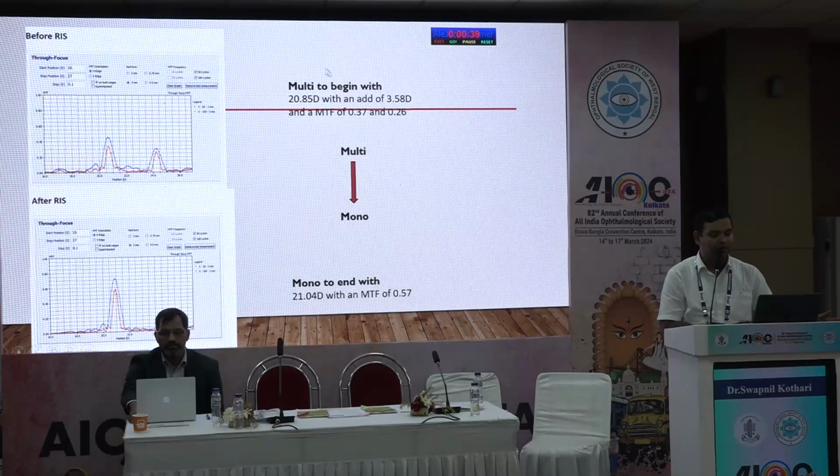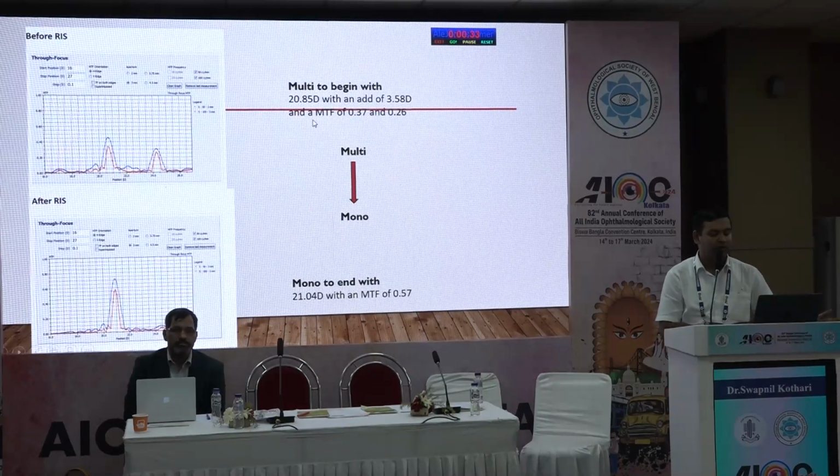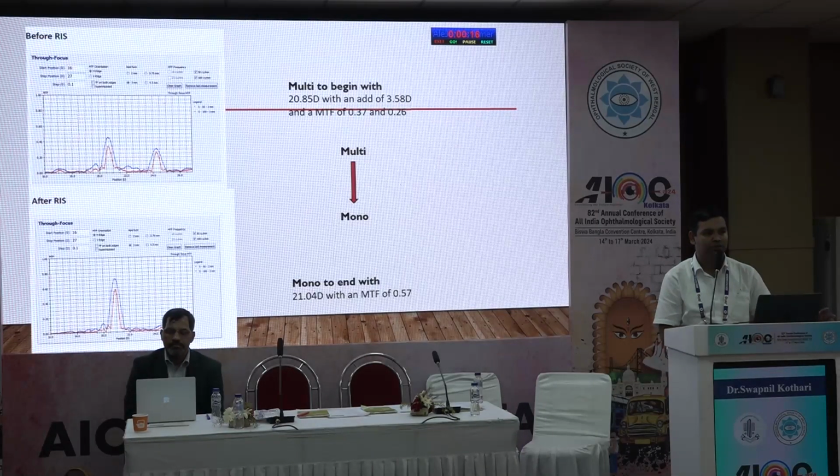The trial eye began with a multifocal lens of 20.85 with an add of 3.58, MTF of 0.37 and 0.26 for distance and near, and ended up with a monofocal of 21.04. So you started with a 20.85 multifocal, you ended up with a monofocal of 21.04, and you also have the option of again repeating the treatment on the same IOL.